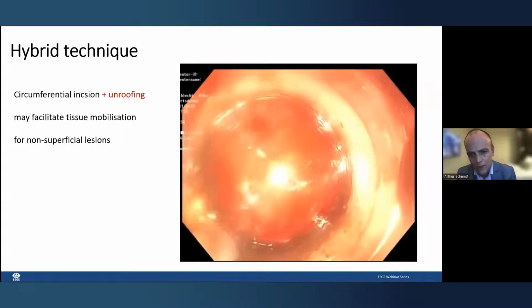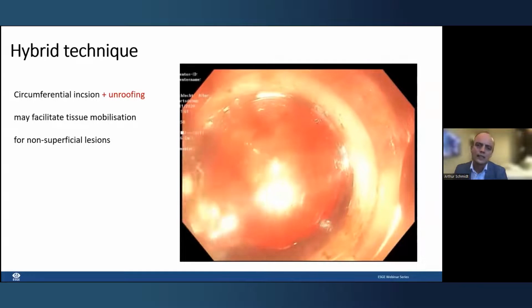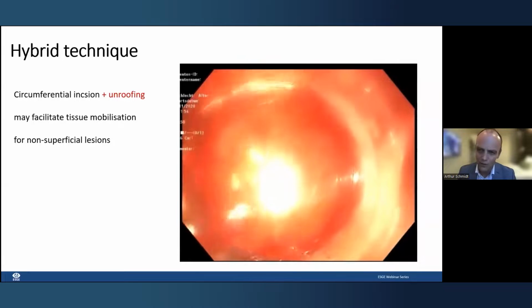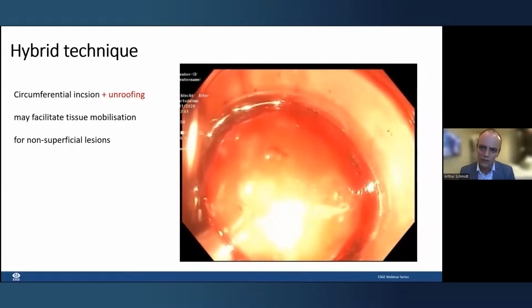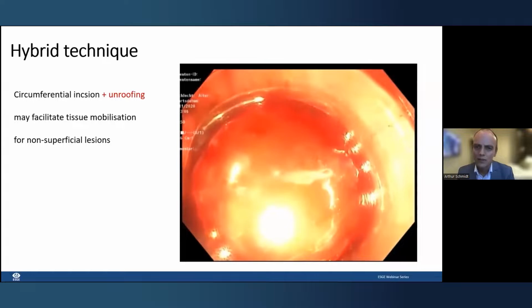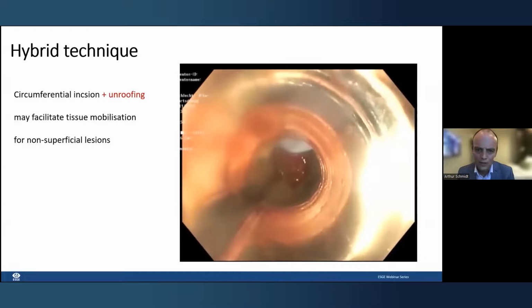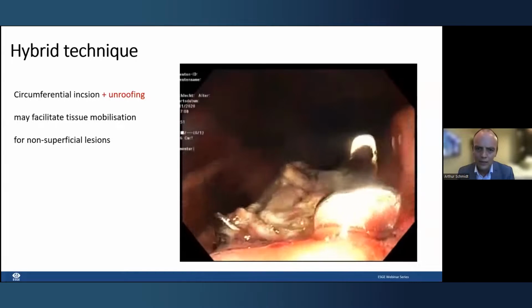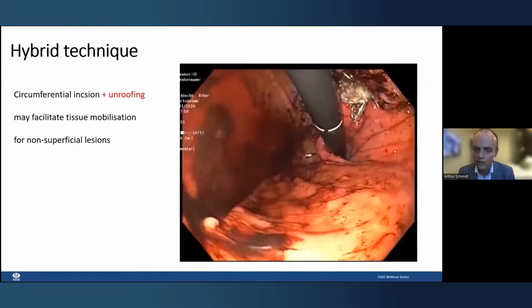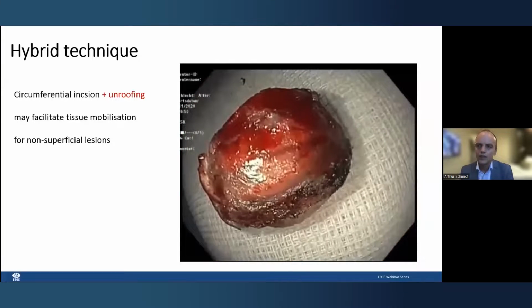And you can see that the incorporation of the tumor into the cap was not easy. It took a while, and we needed traction and also some suction. But still, we were then able to resect this. So the clip was deployed, snare was closed, and the tissue was resected. And you can see here the resection site. And this was a macroscopic complete resection in the proximal gastric corpus.